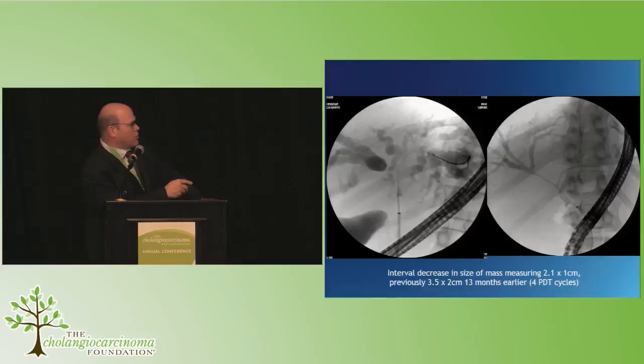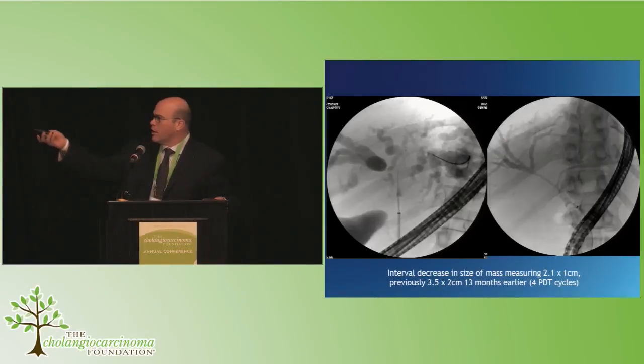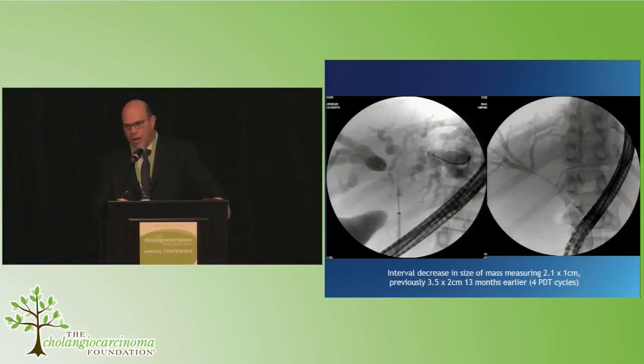And in this image, which is after treatment with photodynamic therapy for just over a year, you can see the bile ducts are now essentially back to normal size, and you can see the X-ray contrast coming down here, and we've been able to restore the biliary patency. Again, the dilated bile ducts, and then the restoration of the biliary patency, the bile ducts are open.